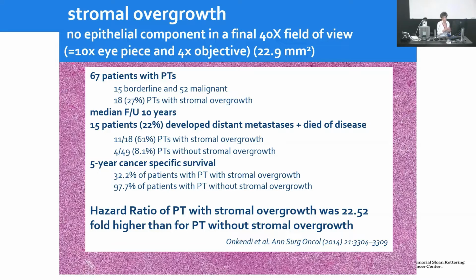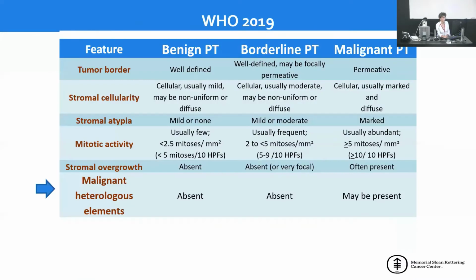And recently, I'm a bit of a compulsive pathologist, but I've started also to mark on the slides how many fields of stromal overgrowth I see. There is one, or there is none, or there are two. And in the end, I think we should have a better assessment of this stromal overgrowth, because there is quite a range between just one focus or two, or 10 foci of stromal overgrowth. We'll see another case that I will present later that makes the point.